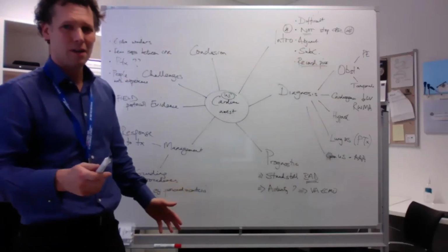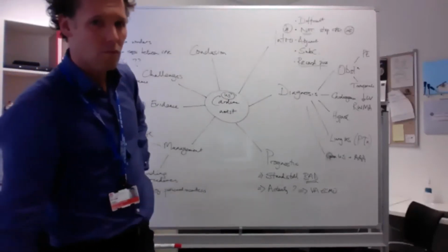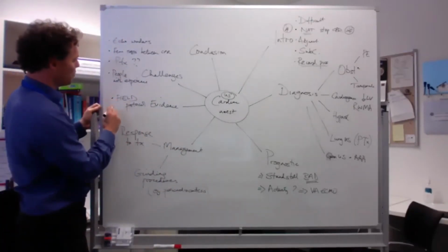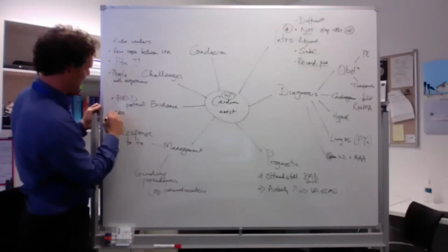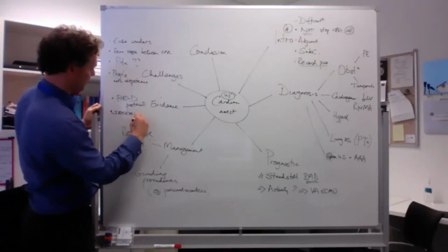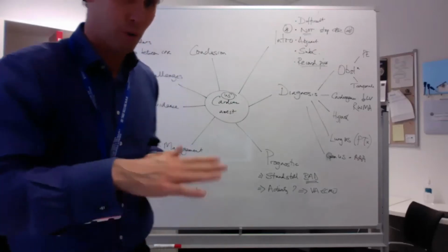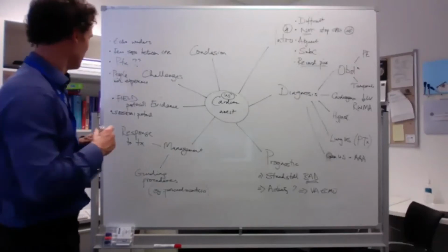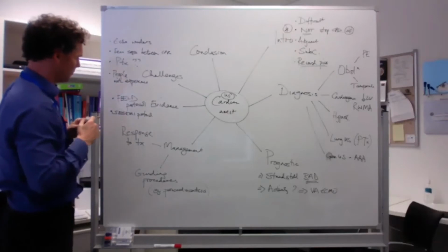As well, Daniel Lichtenstein had his SESAME protocol that had been, again, describing this in prospective trials. Sorry, what's the protocol? SESAME. S-E-S-A-M-E. Yep, SESAME protocol. If you don't mind, if you've got a copy of that, will you send that as well? Yeah, I'll send it. It's the FEEL protocol, F-E-E-L, focused echocardiography in life support. Of course.